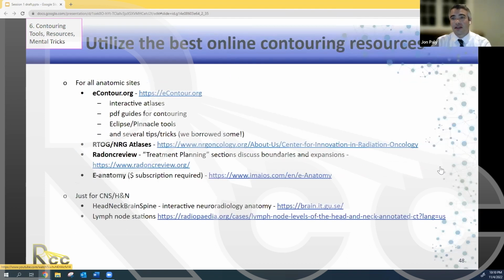Online contouring resources are incredibly helpful. If you get absolutely nothing else from this lecture and remember nothing else that I said, but you remember to check out econtour.org and haven't seen it before, I would consider your attendance today to have been worthwhile. This is a phenomenal resource, and I really encourage you to check it out if you haven't before. It is totally free. You do sign up for it, but it's an interactive atlas, just like looking through your radiation contoured plans, that has everything contoured in it across a variety of different disease sites, or dozens and dozens of different common disease sites and stages.